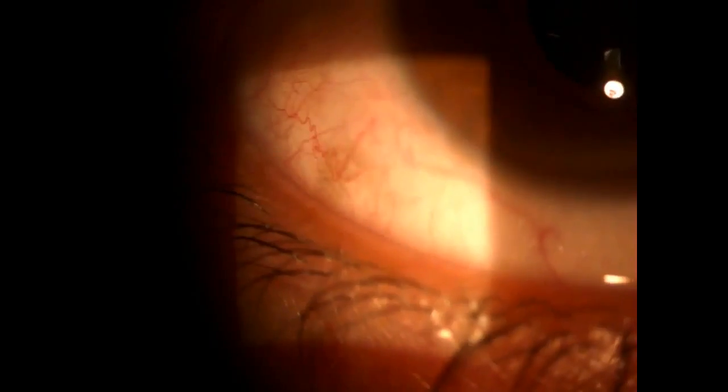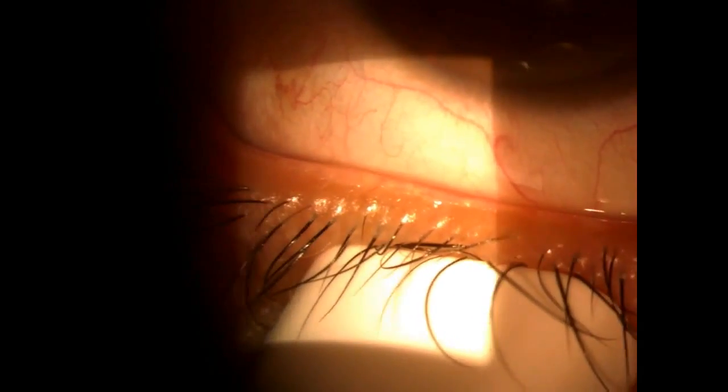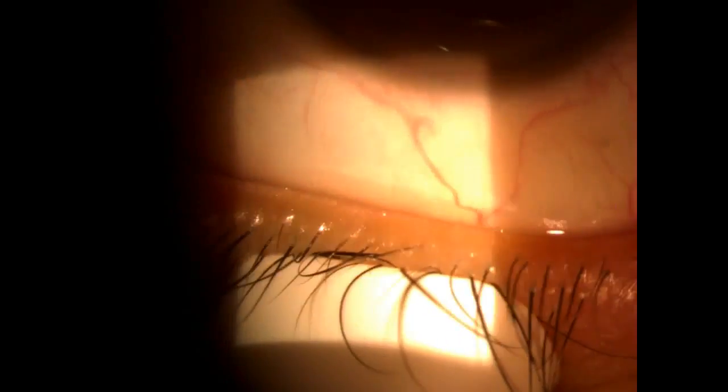The tool I'm using here creates about four or five PSI of pressure. This is the same amount of negative pressure which you have on each blink — your lids create this — and that allows the meibum to come out of the meibomian glands. If there's no meibum that comes out with this tool, then I know that there's obviously some inspissation going on and the patient has some underlying issue.